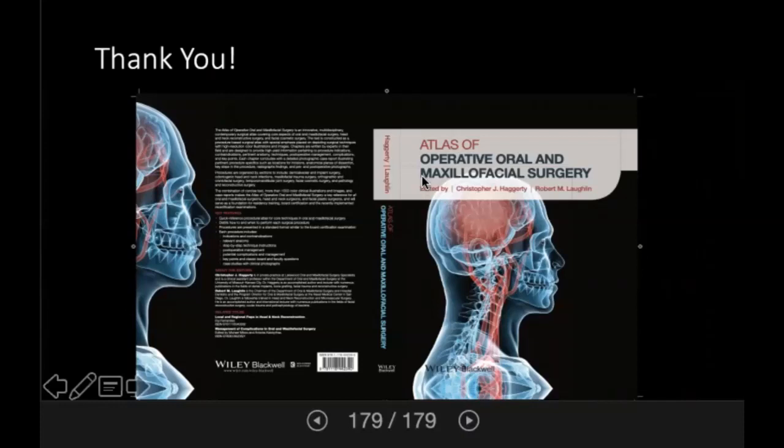That's a very good question, Dr. Moore. A lot of the earlier research showed that the use of 2 or 3 implants in the maxilla for locators was not appropriate, whereas you can do 2 or 3 locators in the mandible. We've learned that by appropriate implant placement, we can place locators in the maxilla. As we briefly discussed in the discussion, a lot of the specialists feel as though you need a minimum of 4 maxillary implants.